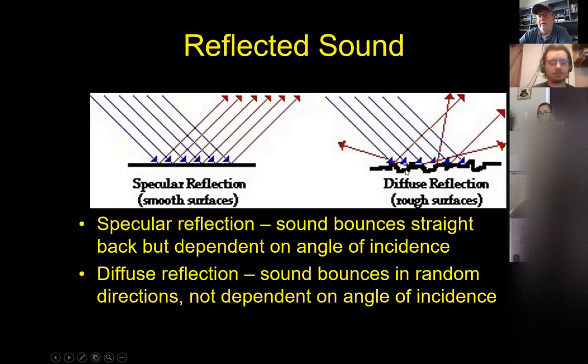On the other hand, if I have a cat with chronic renal disease and the surface of the kidney is very irregular and lumpy bumpy, the picture that I get, because I have less sound that reflected back, is going to be ugly. It's going to be thick-walled, kind of poorly defined, and it's going to be much uglier and less crisp. The resolution's not going to be there. And that's because the surface is roughened in appearance and sound is bouncing off in every direction.